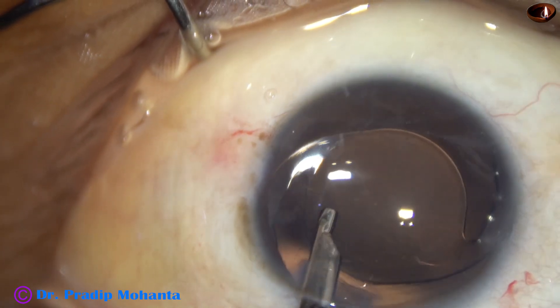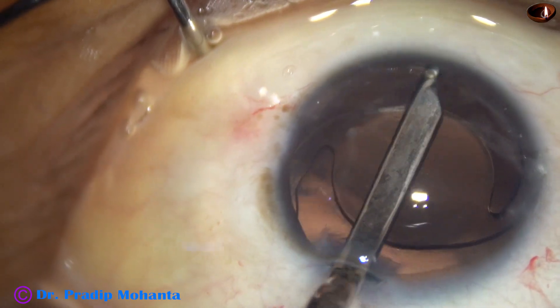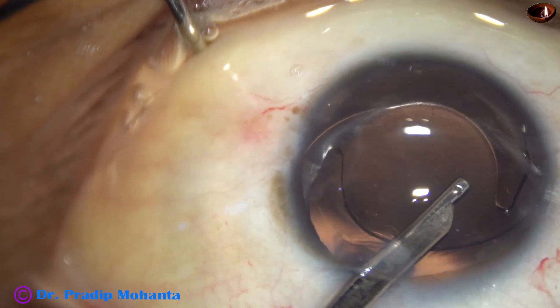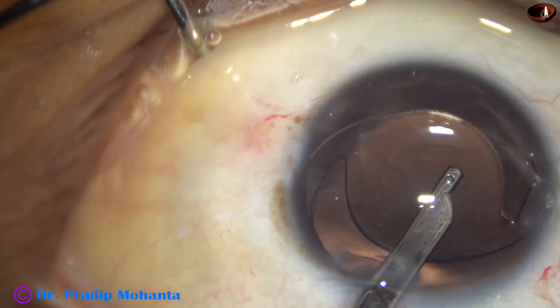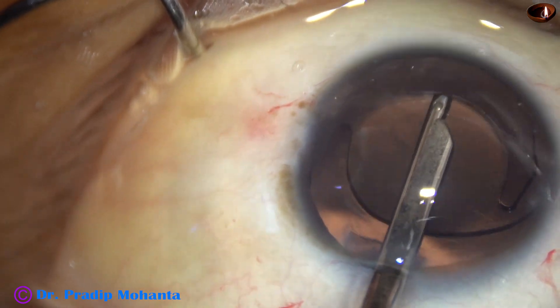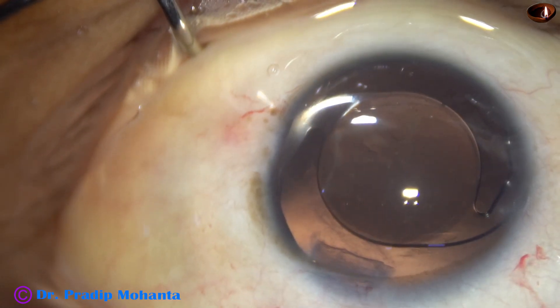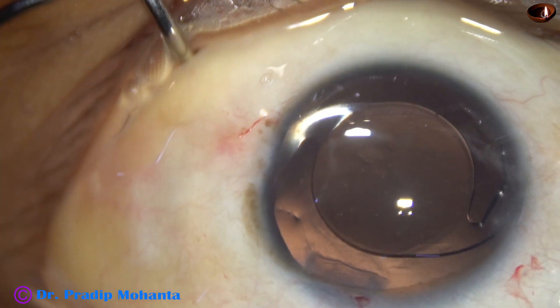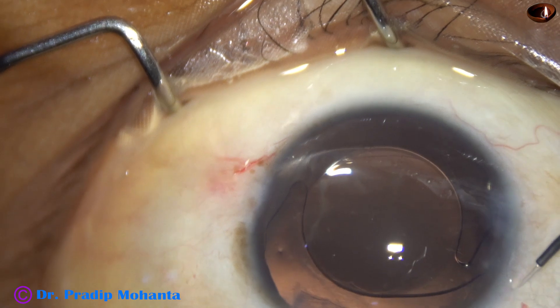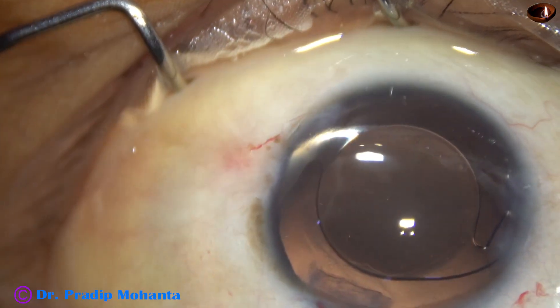Now, the viscoelastic substance used to place the lens in the capsular bag is thoroughly removed. I used not only the Simcoe cannula but also bimanual irrigation-aspiration for removal of the visco. I am not going to show that portion of the video because the video is already getting quite long. After cleaning the visco nicely, the side ports are closed by hydrating the corneal stroma on either side of the incisions. Both the incisions are closed.